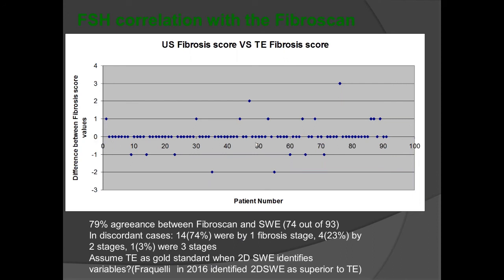We've been doing some incidental work with elastography of the liver and looking at HCCs. It's interesting because we know that with other areas, when you develop a malignancy, the thought process is that malignancies are stiffer than surrounding tissue. Of course, in a cirrhotic liver, it's the opposite.